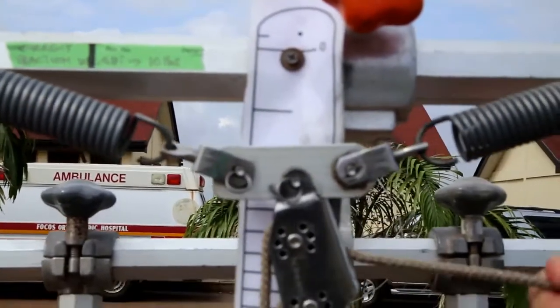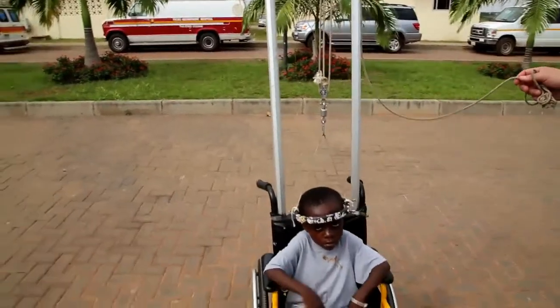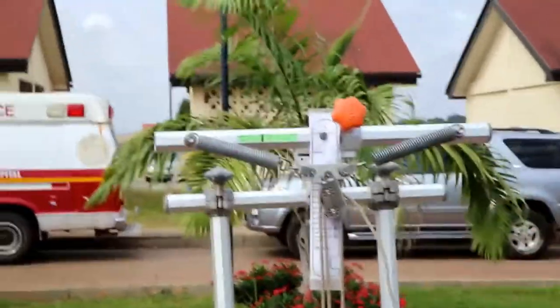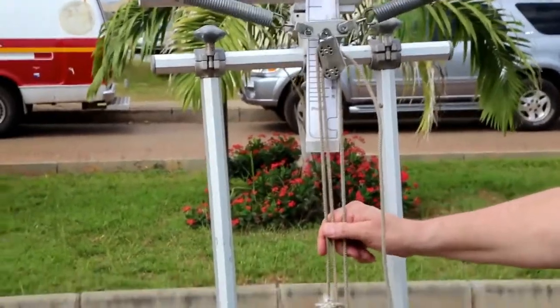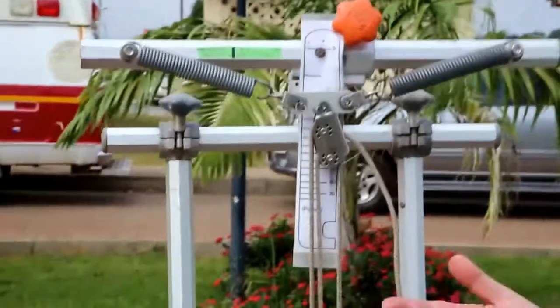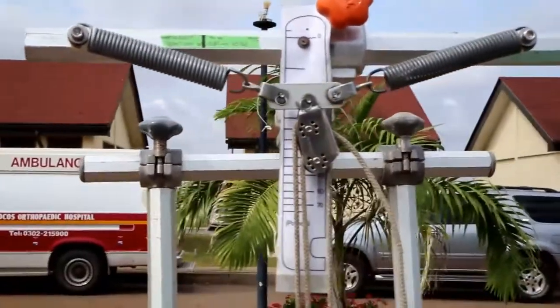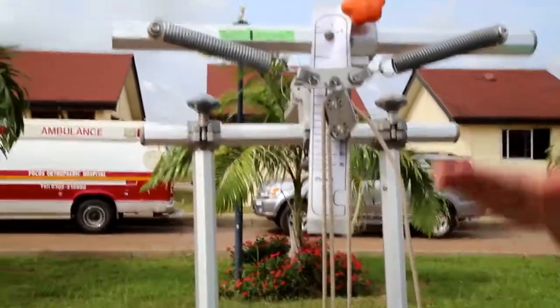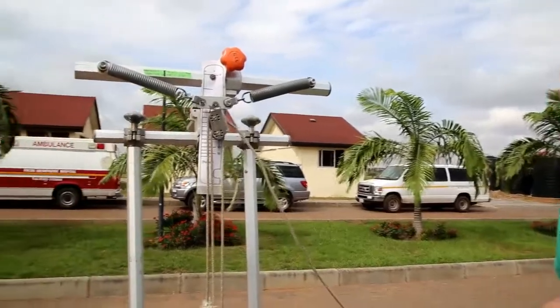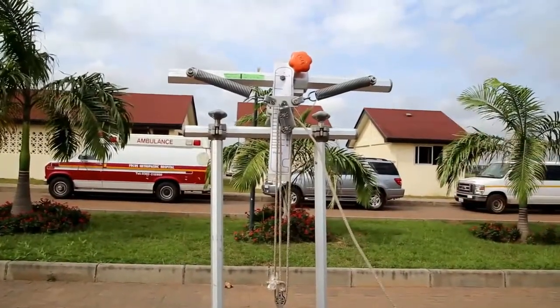As the patient sits forward or back or leans up or down, the reading will change slightly — basically a pound in one direction or another. If the patient rolls along and hits a bump, the spring will bounce a little. Unlike a dead weight where the load is all on or all off very suddenly, with this spring-loaded system it is a much softer transition. You don't put nearly as much stress on the halo pins. With the spring, you always have a little tension at all times, so it doesn't put so much wear and tear. As he moves around in the chair, this will move slightly up and down — that's okay, it's not an exact science, and it automatically adjusts to his position in the chair.